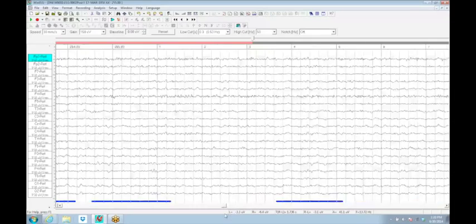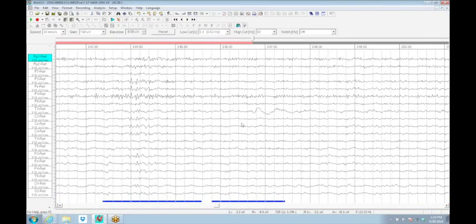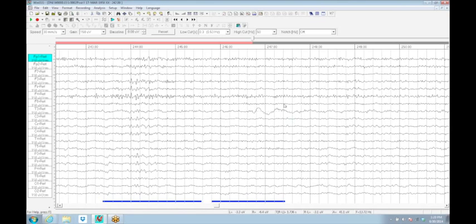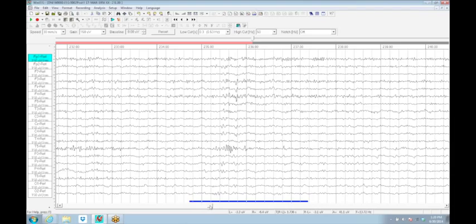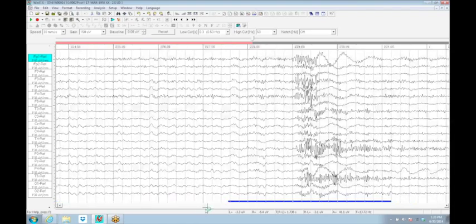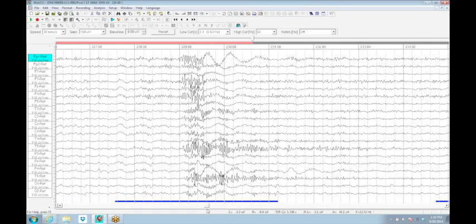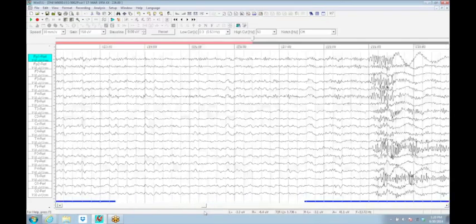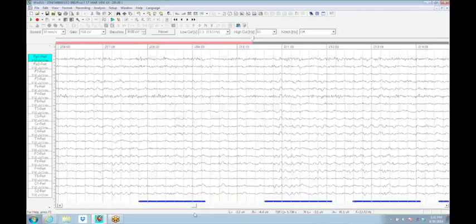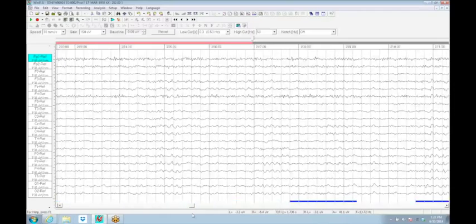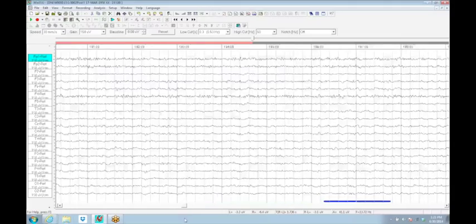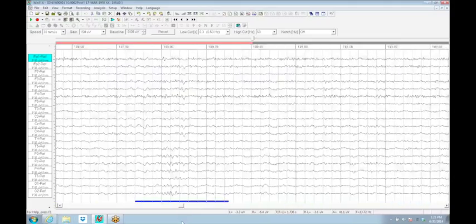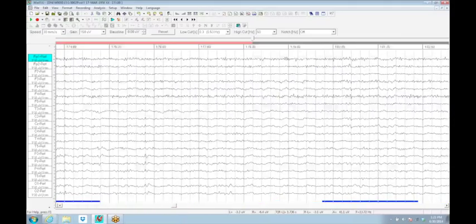There will be some as we go through here that we probably are going to want to fine tune to get rid of this T3 bigger slow wave bump. But you can see the destruction of the EEG. We'd want to pull some of this out because of the muscle. There's a lot of EEG, and here's another piece we would have wanted to throw out. But there's lots of it here that we would have allowed very nicely as valid, clean pieces of the EEG.